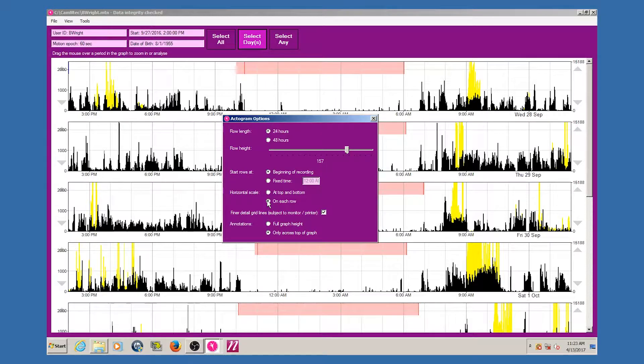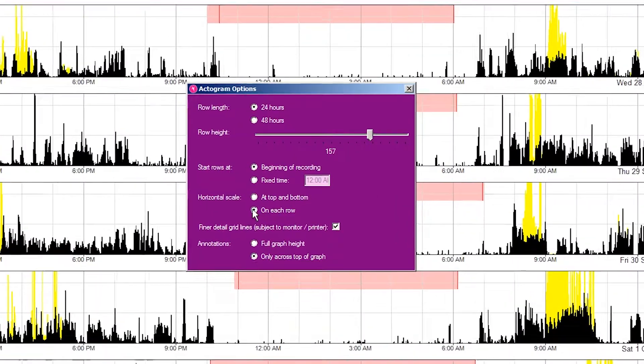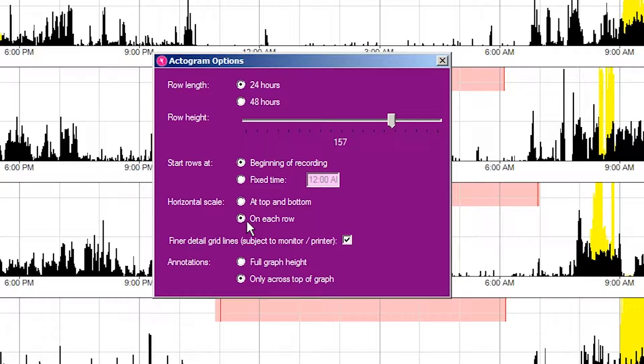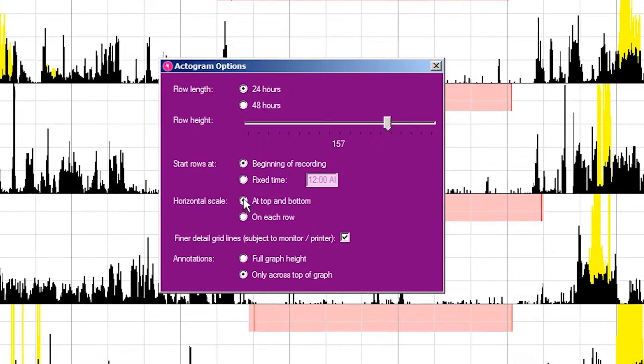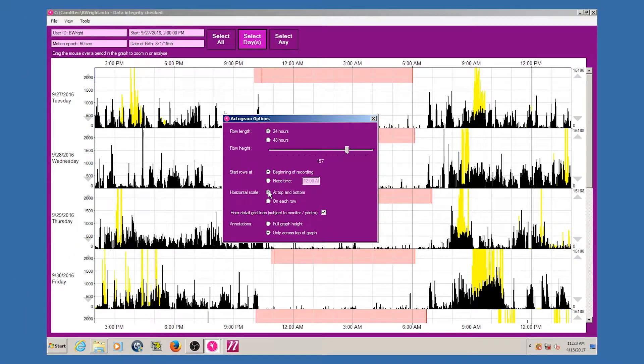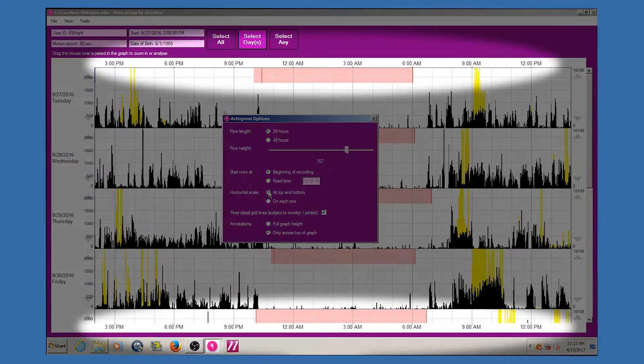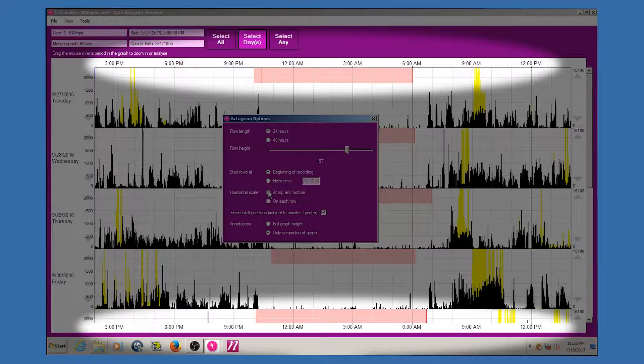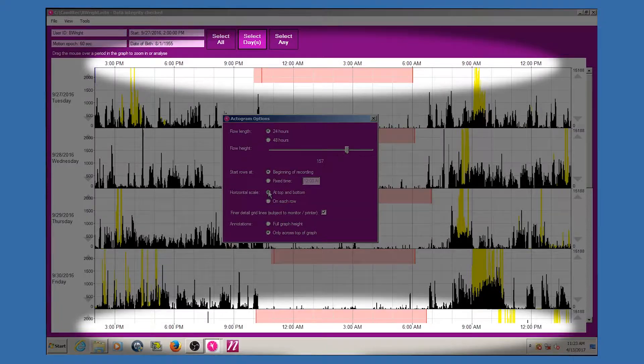Using the horizontal scale options, you can choose to show self-contained graphs with a horizontal scale on each row, or close fitted graphs with no horizontal axis on each. In the latter case, a time scale is added at the top and bottom of the actogram instead.